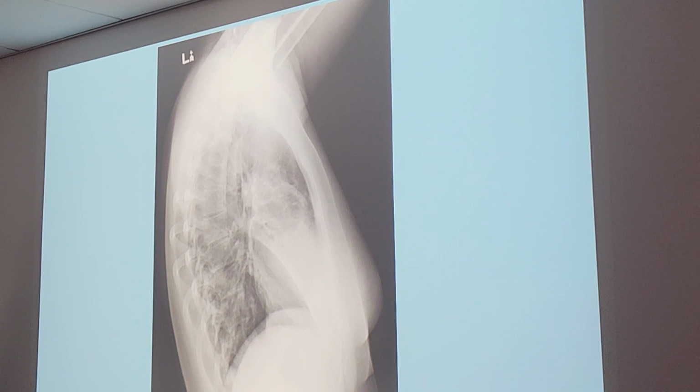What about detail sharpness? You should increase the contrast. Contrast could be better. It's not terrible, but it could be better. Any artifacts? We don't see any. Any distortion? Maybe some slight distortion in the front. I don't know what's going on over there. Yeah, good job. Anything else?